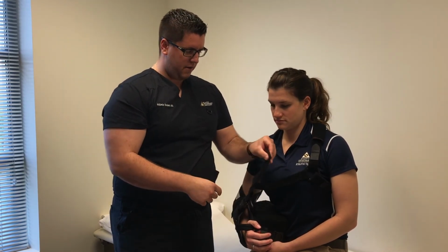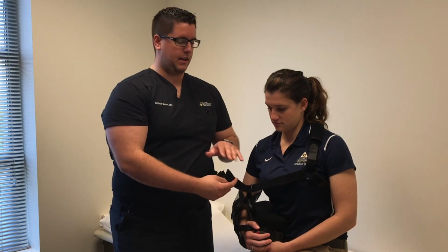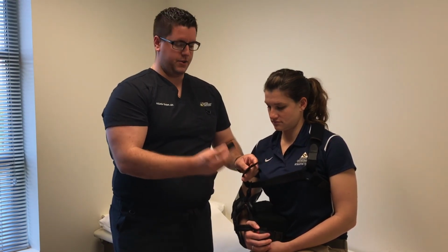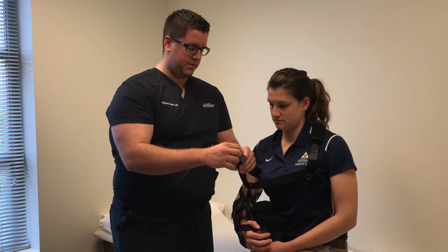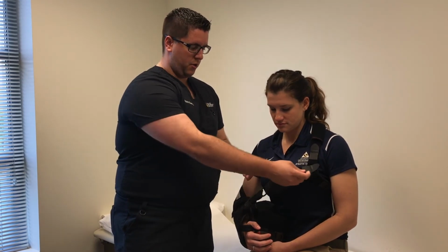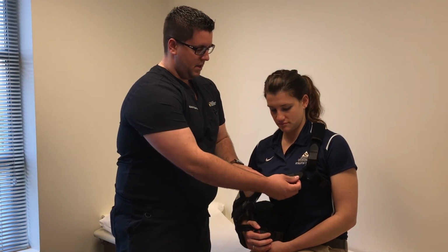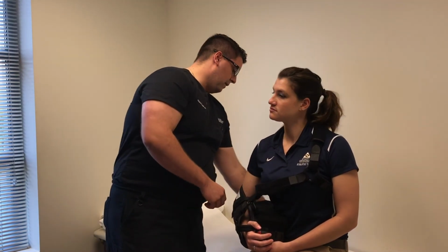And you can take those off, and if you have a lot of extra sling after you've adjusted all of them, you can go ahead and cut this as well. And then just reapply this over the tip of the sling. And then you can shorten it up to the distance that you need it to be. And then lastly, we will apply the swath.